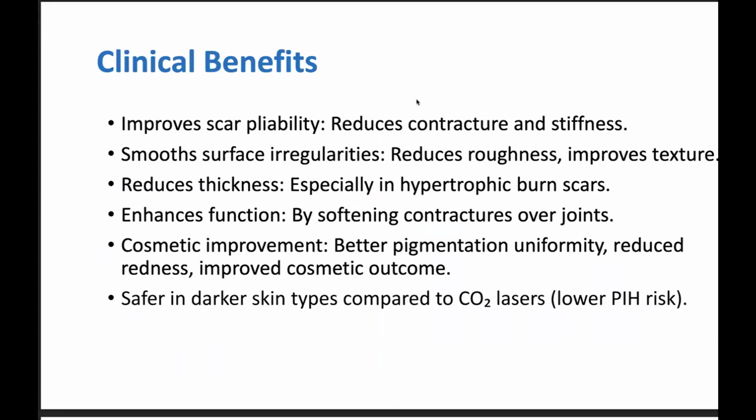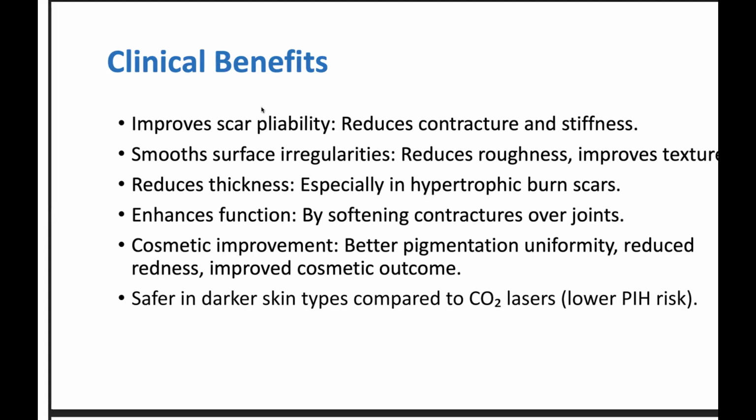Next. The clinical benefits of fractional laser treatment are improved scar pliability and reduced contracture and stiffness. The fractional laser can also smooth surface irregularities, reduce roughness, improve texture, and reduce scar thickness, especially in hypertrophic burn scars. It can also enhance function by softening contractures over joints. The cosmetic improvement is very important for the patients.